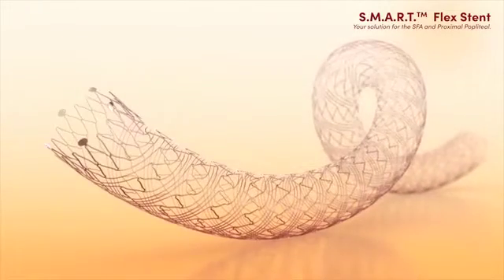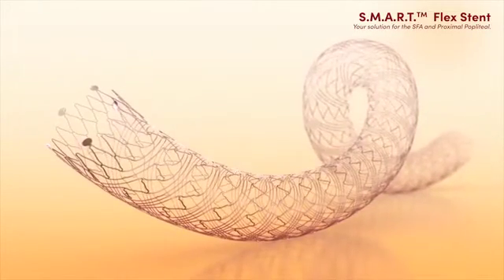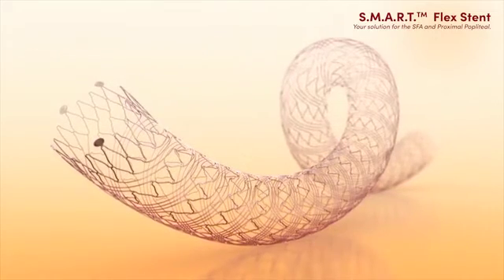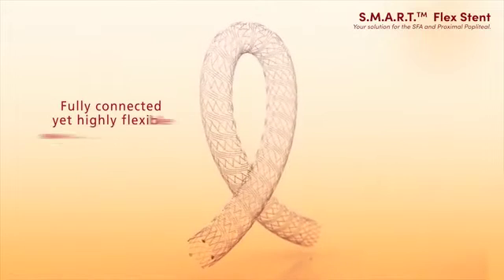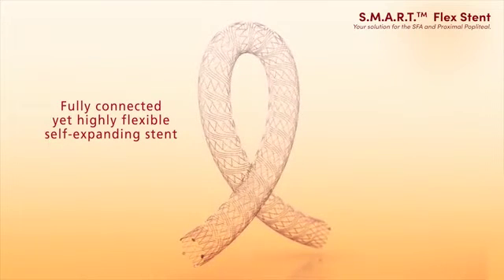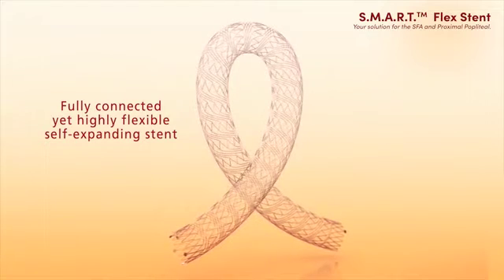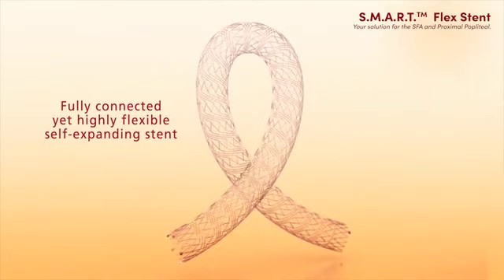The helical stent geometry of the SmartFlex stent provides for high durability and superior fracture resistance. SmartFlex stent — the first fully connected yet highly flexible self-expanding stent. Your solution for the superficial femoral artery and proximal popliteal.